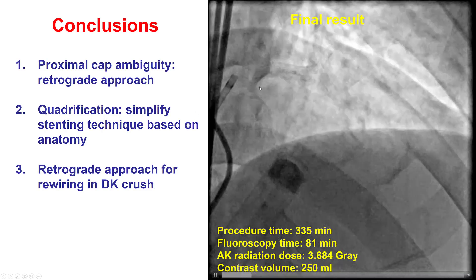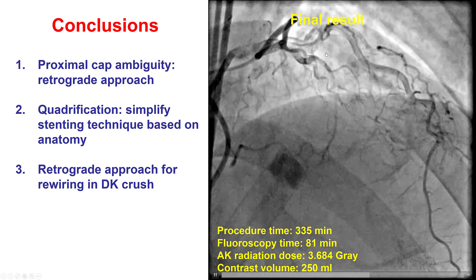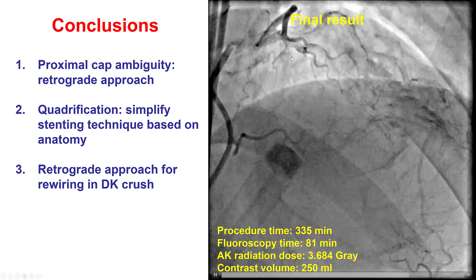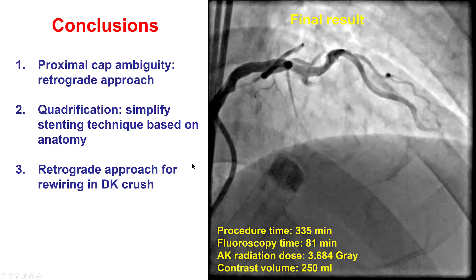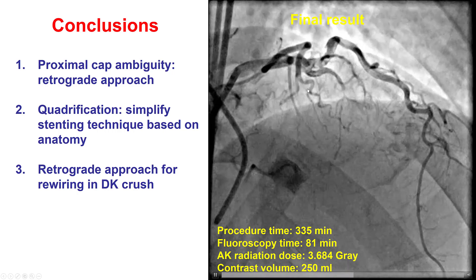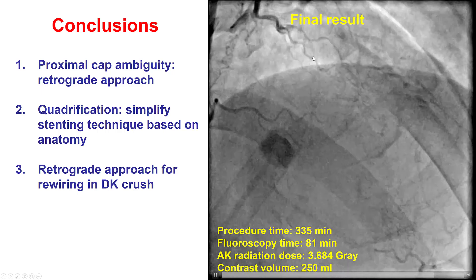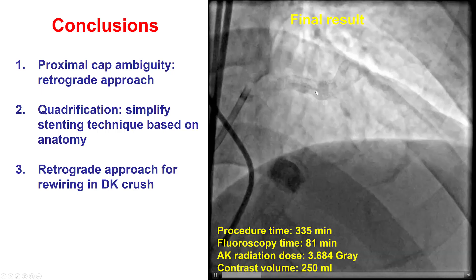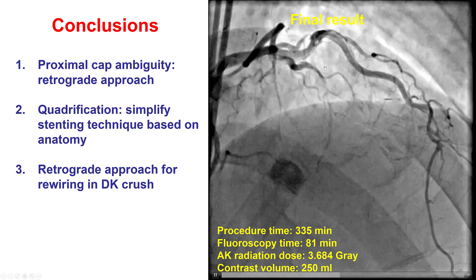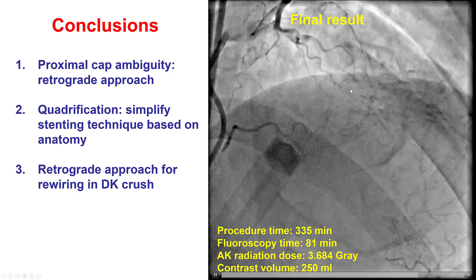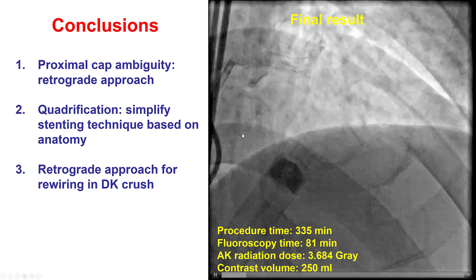In the cranial shot, there is very good flow into the diagonal branch, the dissection is covered, but the flow in the LAD is suboptimal. We determined that we would not pursue further at this point, but bring the patient back depending on his symptoms for potentially re-treating the LAD.